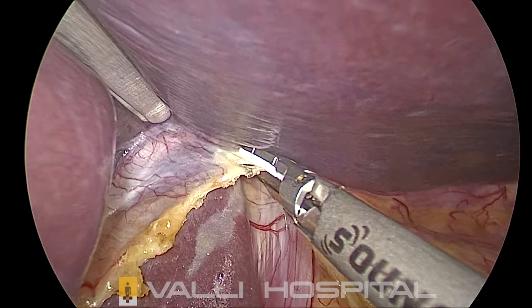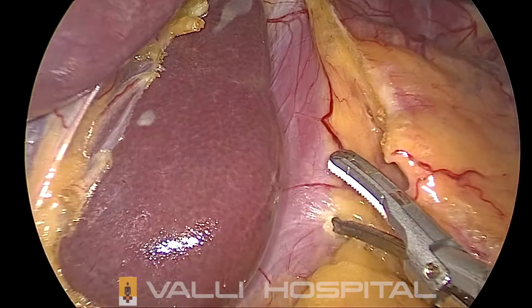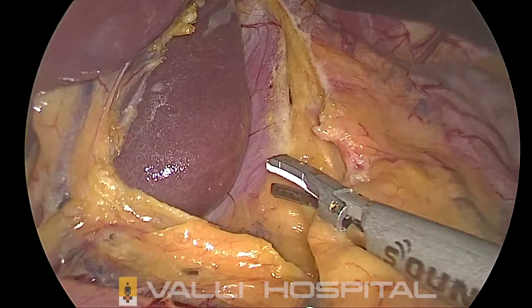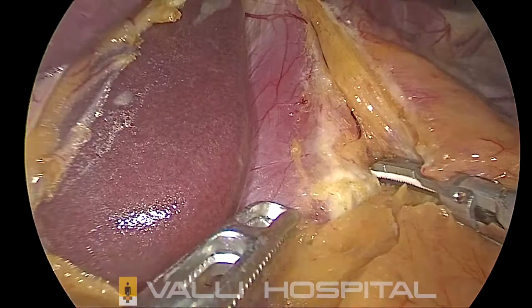Now I am dividing closer to the hiatus. Once the pars flaccida is divided, the right crus comes into view. Now you have to develop a cleavage between the right crus and the esophagus. You have to go in small increments. The technique is, use the active blade of the harmonic first to create a plane. Don't go too deep. You should not go into the esophagus, or you should not go into the muscle of the right crus. Go in small increments. Once you find the cleavage, keep on cutting.